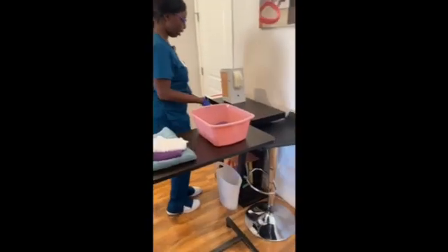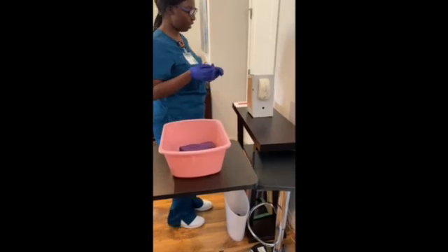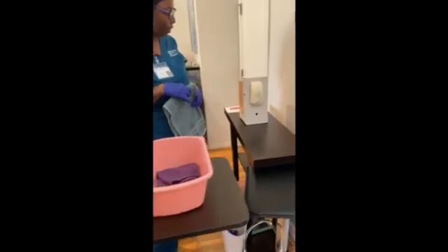Okay, so I'm just going to raise the bed to a proper working height as well as put the side rail down. So Mrs. Taylor, we're going to start with some peri care.